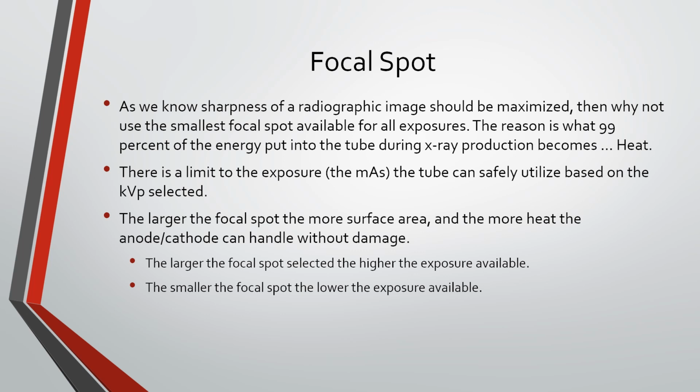So right here, this is the main reason why we might select large focal spot over small focal spot, because we need a higher technique based on the kVp, or we need a higher kVp and mAs. So we need a higher technique overall, so we need to use the larger focal spot perhaps than the smaller focal spot in certain situations, even though the resolution of the image will be lower.